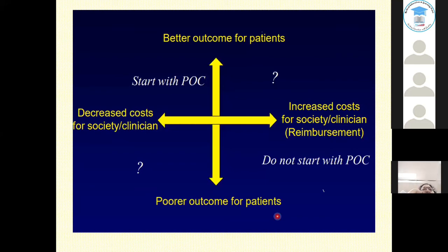I'm not saying that real-time QC is an option, but if it isn't, then please make it easier for your staff by getting the glucometers to your laboratory, handling the QC material yourself. That is, IQC materials are normally provided with all glucometers. What you can do is devise a program where you get the glucometers to your laboratory maybe once a month and run the IQC and the interpretation yourselves.